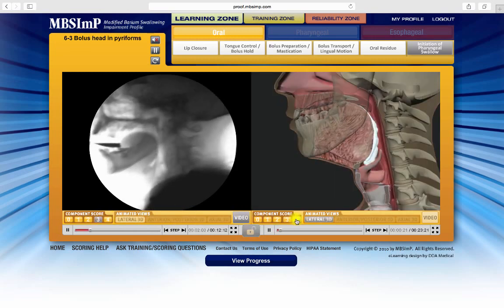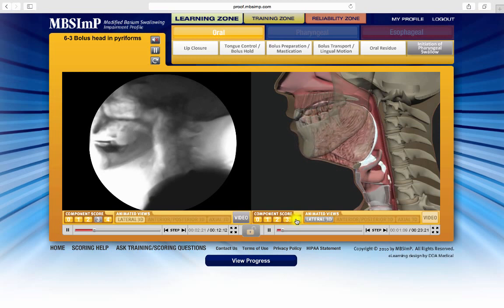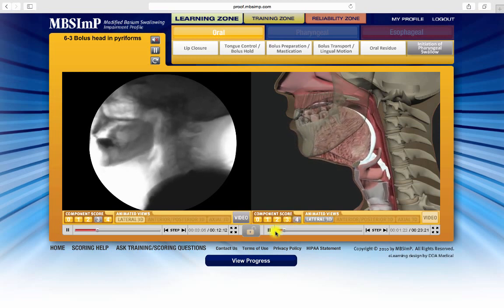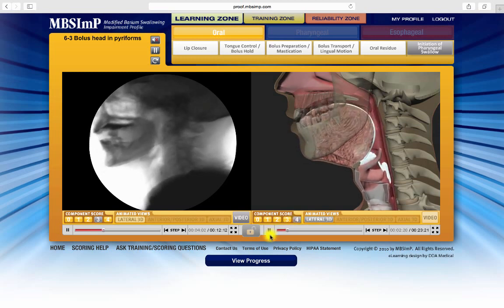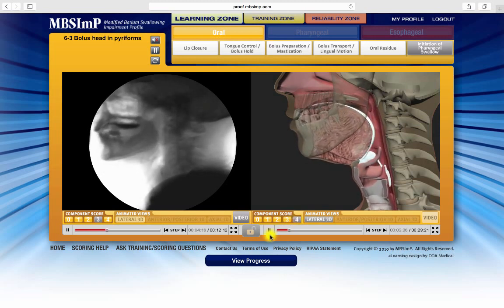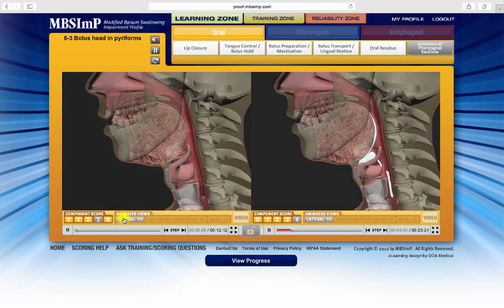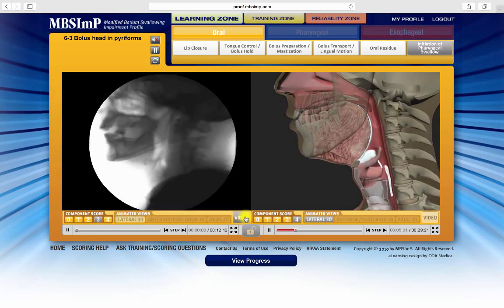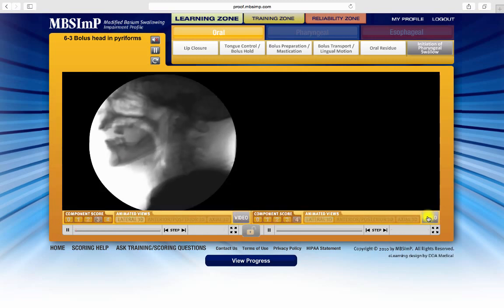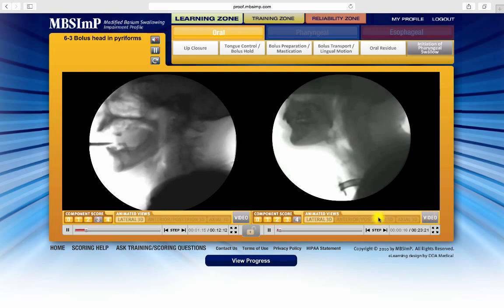The fluoroscopy video and animation can be substituted for one another in either or both windows by clicking here, here, here, and here.